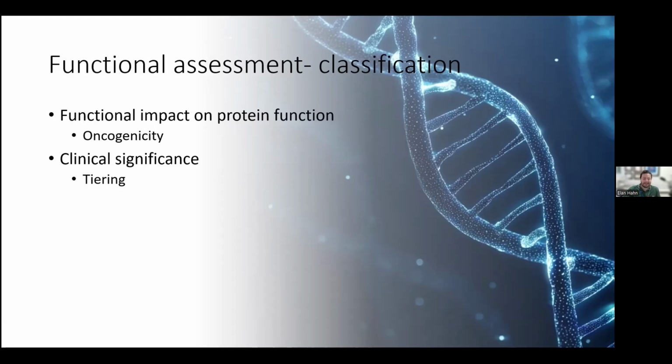But in the absence of germline testing, even with a family history and a high allele frequency, we still can't be certain that they're only present in the tumor. So, in a number of instances, there are significant differences in clinical implications depending on if it's somatic or germline. In such cases, germline testing should be considered to confirm germline or somatic origin.